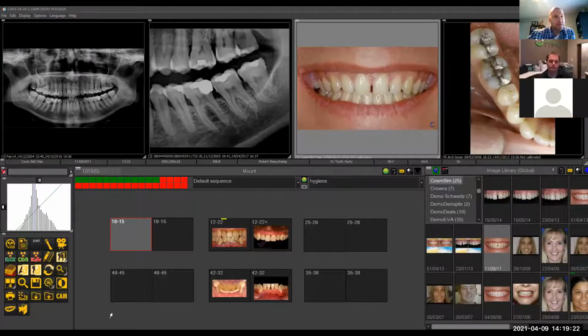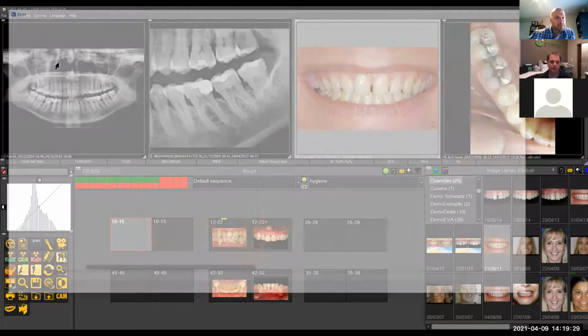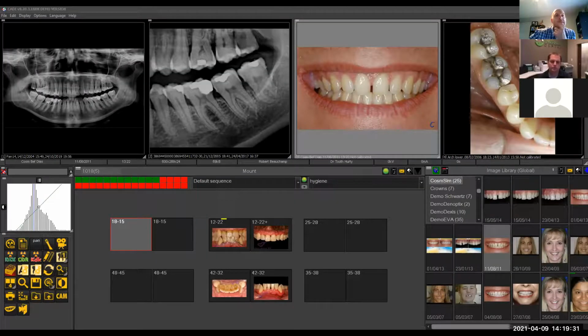Let me just look at something here quickly. It's something I'd be interested to play with for sure. Let me just see if I have. Let's see what time we've got.